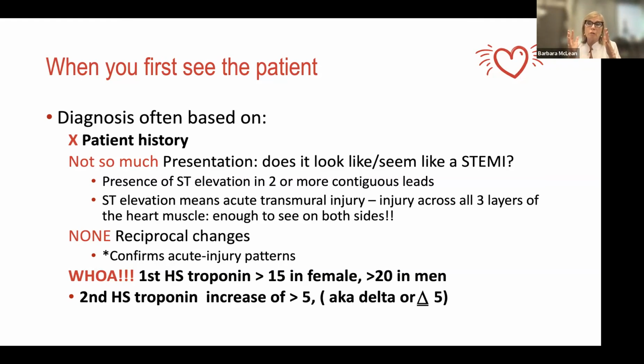So I really want to encourage everybody to work hard to have an EKG machine in your area, to learn how to use it, learn how to load it, learn how to communicate it to your cardiologist. Just doing the EKG is not enough. You've got to be able to electronically load it and communicate it, so you've got somebody who's got your back who's looking at that EKG.